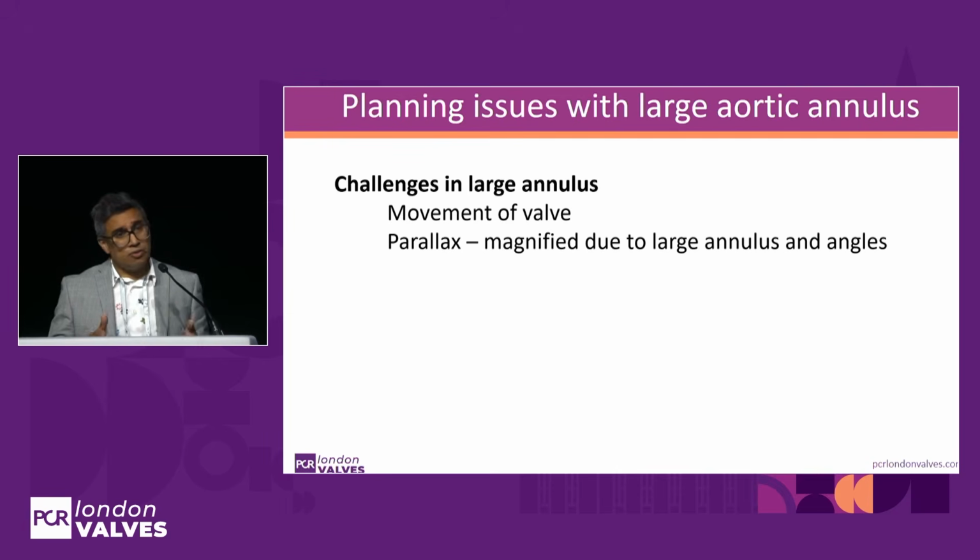The LVOTs can also be large, and depending on the design of your valve, if you've got a very large LVOT, there's a tendency for certain valve platforms to dive into the ventricle. And probably the most important thing when implanting these valves, the self-expanding valves in particular, is this issue of parallax.